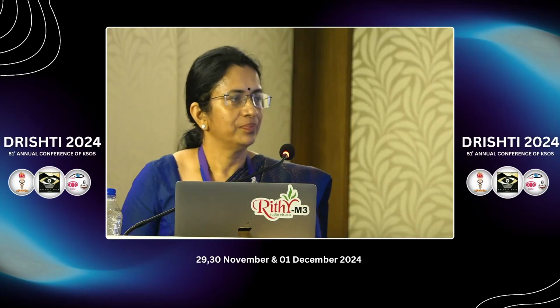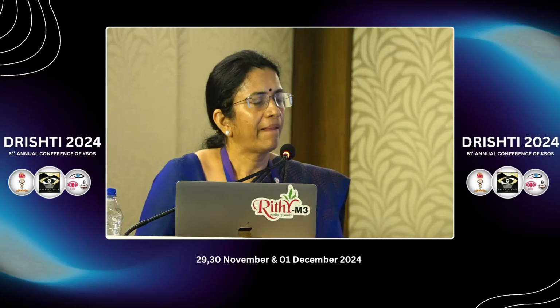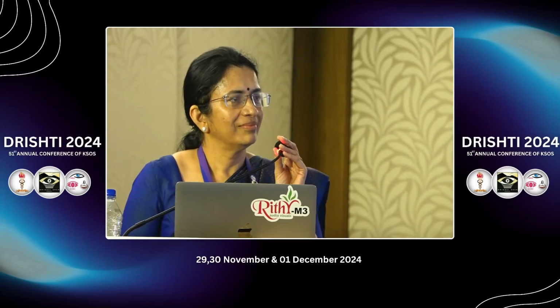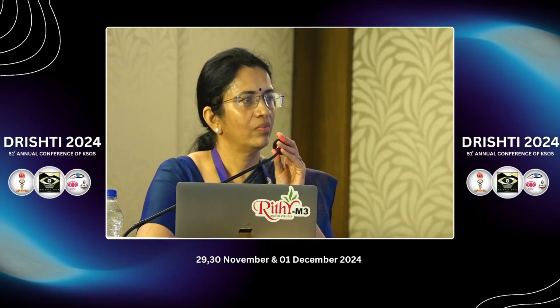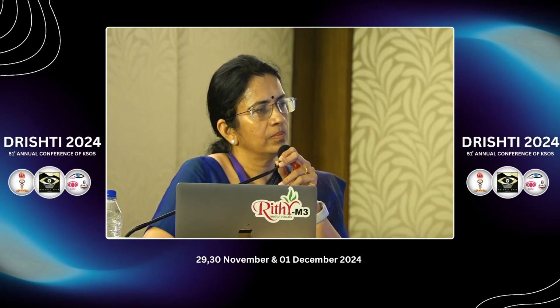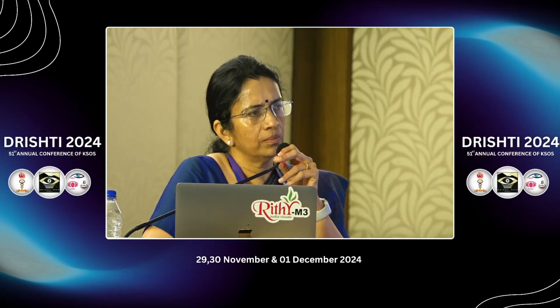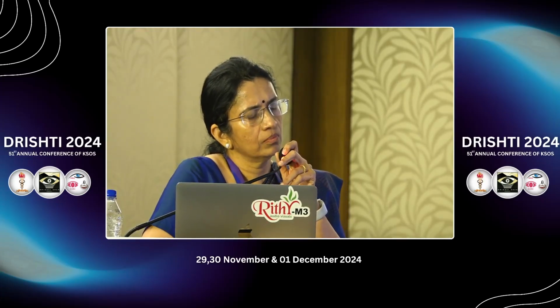Thank you, Dr. Sandhya, for those excellent demonstrative videos. I have a question. Maybe it is stupid, but do you have any IOL preferences when you do surgery? The type of IOL, single piece or multi-piece? Once or twice, when I've done pediatric cataract surgery, we had a patient with PHPV, and I put a single piece in the bag, and the VR surgeon had to go from behind and cut the plaque. The single piece just came out. So now I just make sure that you always use a three-piece lens.